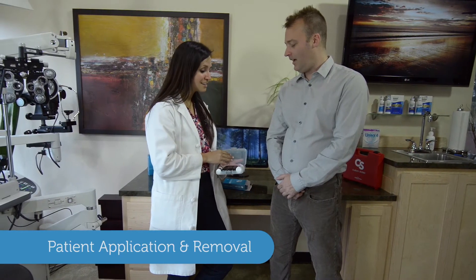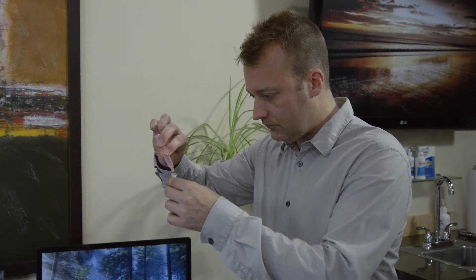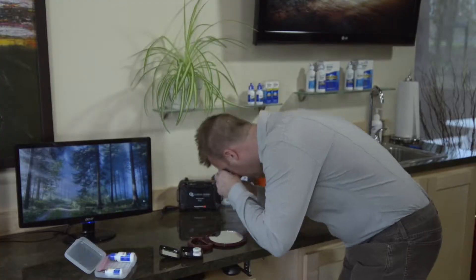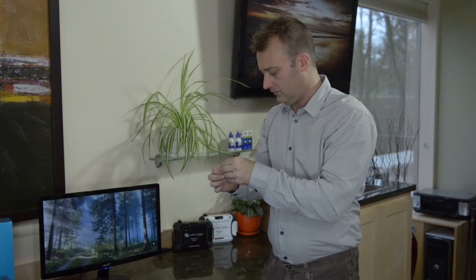Application and removal by the patient is also very simple. Typically this is done over a mirror on a countertop but can be done without. The patient prepares the lens and fills it with saline, then uses either a snipped DMV tool or the tripod method to apply the lens. The smaller DMV tool is recommended for removal — gently adhere it to the outer edge of the front surface and pivot in a rocking motion. If the lens is slightly suctioned on, irrigate with saline solution.